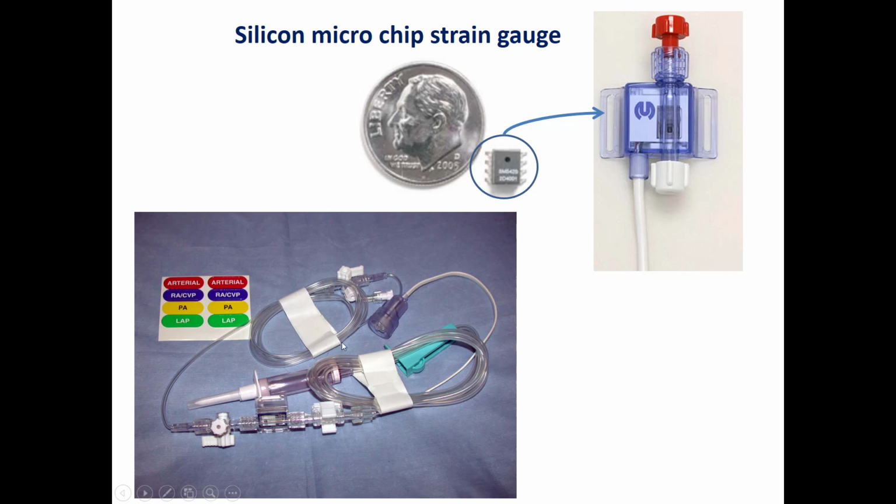For this, we use heparinized saline, which is a bag put here under certain pressure and a specific slow flow. So the heparinized saline will be transmitted through this line, through the pressure sensor, through this line to the catheter. So this line is always filled with heparinized saline to avoid the clotting of the blood and the formation of a clot.